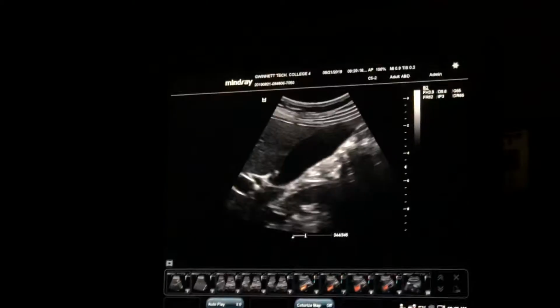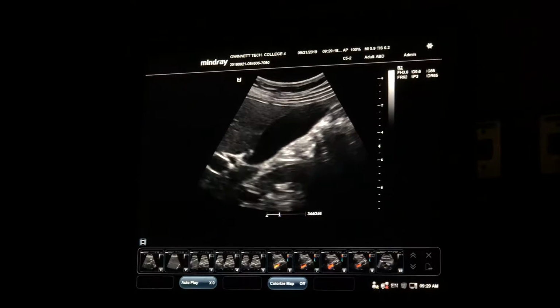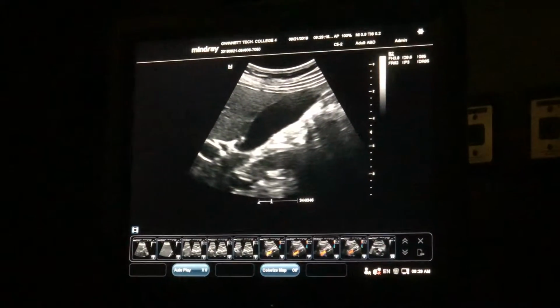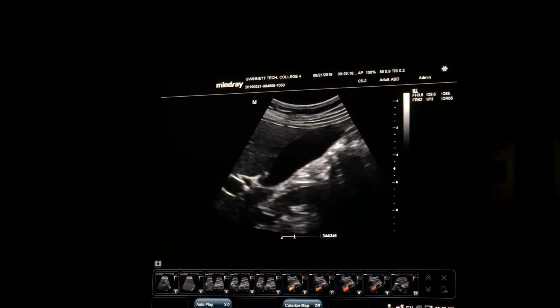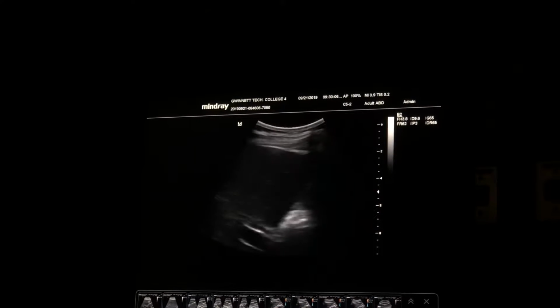But that was a really cool experience for me, because I was like, wow, I can keep my eye on my organs even after I've done something. Even after I've completed my evaluation of an organ, it's still in my picture somewhere, I'm still looking at it. So I was able to see that. Like on me, you can't see my polyp right here at all. Exactly, but you can catch a little glimpse of it when I was over here in coronal.